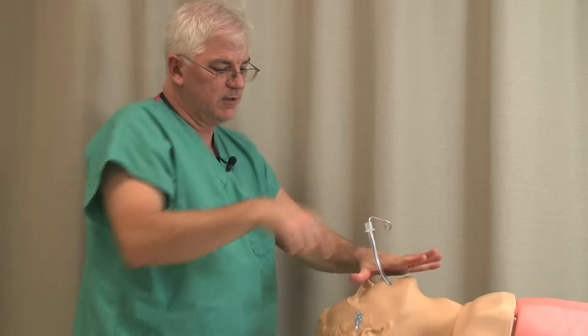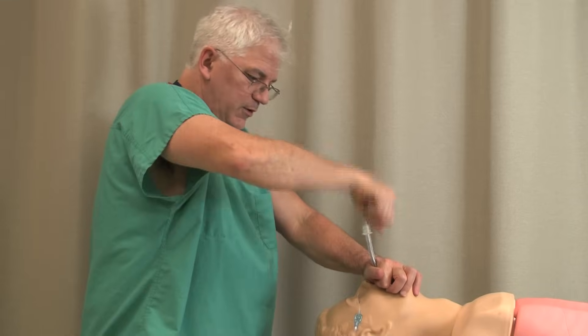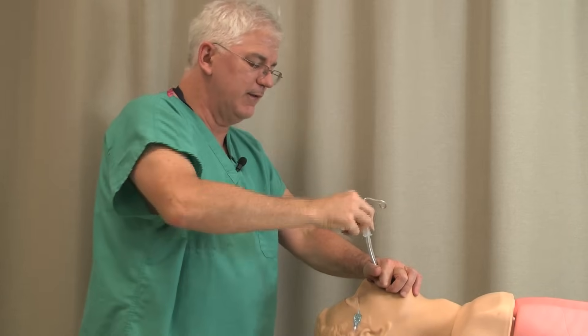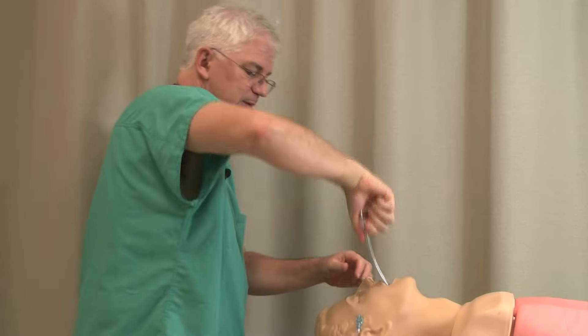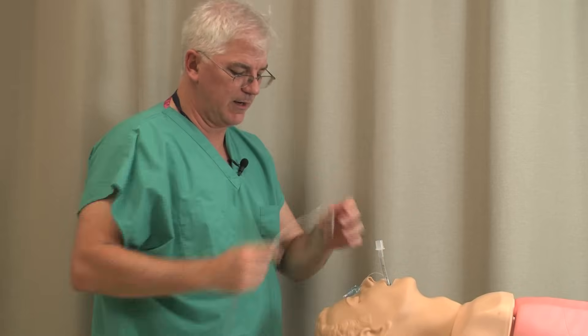Notice how I hang on to the endotracheal tube here — you went through all the trouble to put it in. When you pull the stylet out, make sure you hold on to the tube. I've seen people pull the whole thing out when they're pulling out the stylet, and you don't want that to happen. So pull the stylet out carefully.